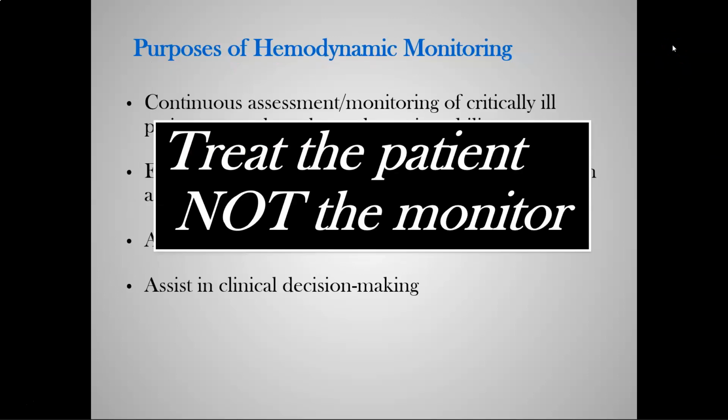There's one golden rule. I really like it. I am 100% in agreement with it. And I think I've even shared with previous classes a story, and I always go back to it: don't treat the monitor. I know that might sound silly, and I'm sure most people called it silly until the nurse sees the monitor go flat while the patient is sleeping, goes into asystole, immediately hits the code blue button and starts compressions, and forgets that all-too-important critical step of checking for a pulse.